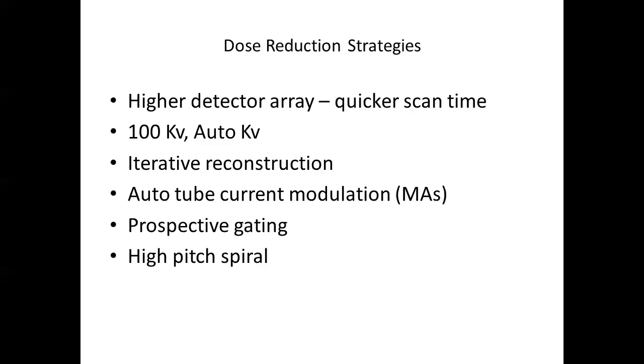If it's irregular, then yes, we'll go to retrospective. Yeah. So, and we'll talk about the different sequences in a second, but you're right. High pitch spiral, I don't know if you guys have heard me use the term flash. That's the Siemens name for the high pitch spiral.